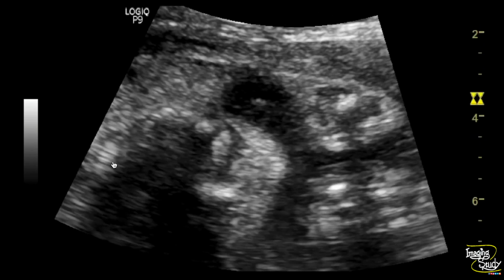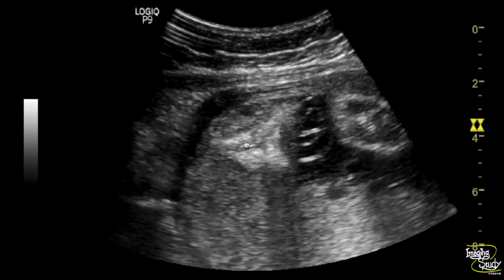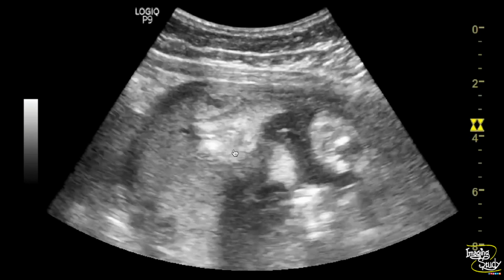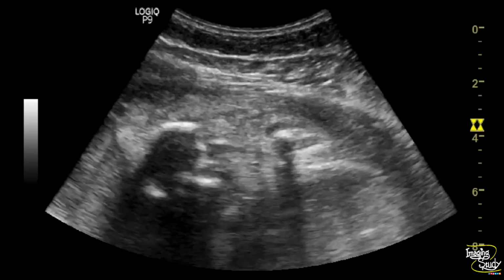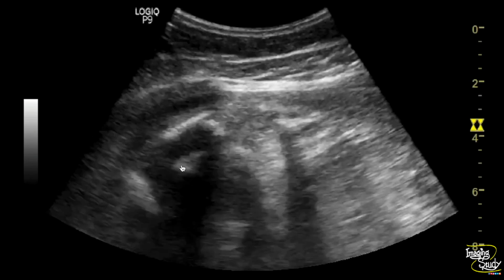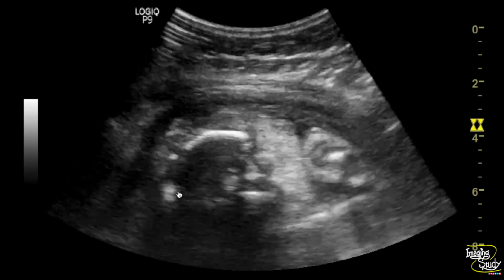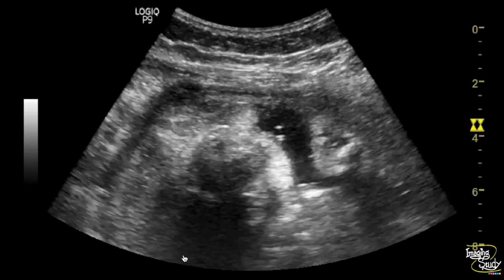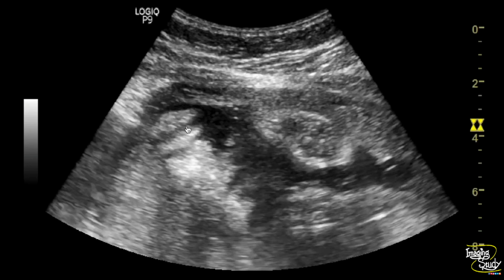Here you can see the eyelids, and this is the brain tissue outside the fetal head, making the fetal head small in size, that is the microcephaly. The placenta is posterior, so these are the brain matters. Here's the gap, you can see now quite well visualized at the parietal region. This is the brain matter. The finger-like areas are the gyri. The fluid-like area that you are seeing here is the umbilical cord.